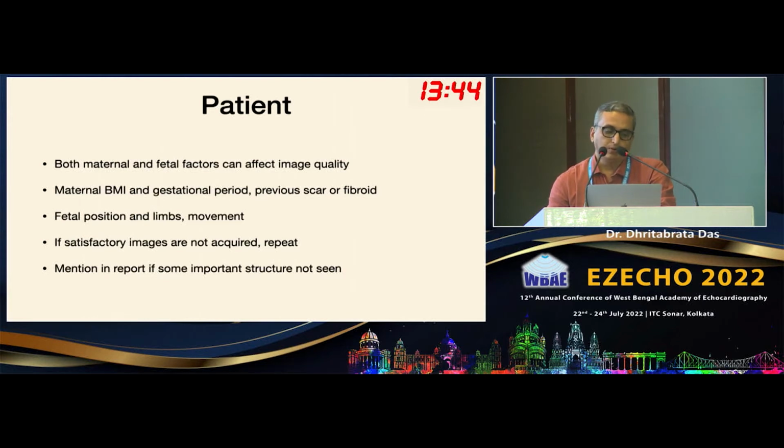One thing is very important. If you are not satisfied with the images, then always repeat it. You can call the patient maybe after half an hour or 1 hour, and you can see the fetus in a more favorable position. And in spite of your best efforts, if it is not possible, you can call the patient another day, and if you cannot see an important structure, always mention that in the report.